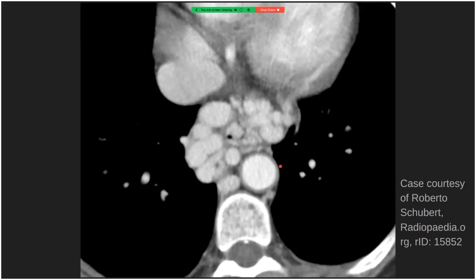This cross-sectional image at the level of the lower esophagus shows the heart anteriorly, vertebral bodies, aorta, and IVC entering the heart. There are multiple dilated vessels at the level of the lower esophagus consistent with varices. These varices can be prominent when the patient is lying down on a barium esophagram and disappear when the patient stands up, which can help distinguish them from a persistent filling defect.